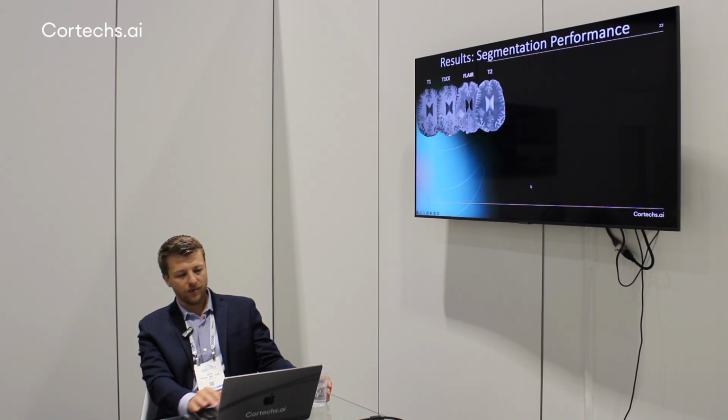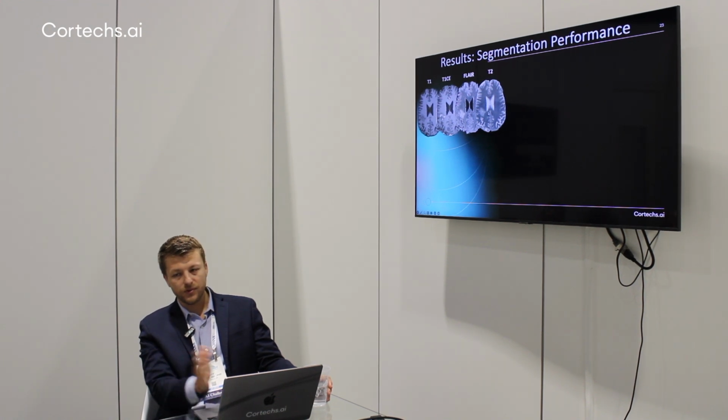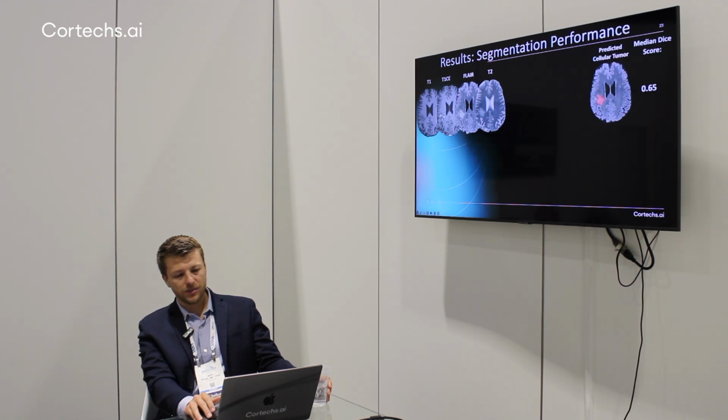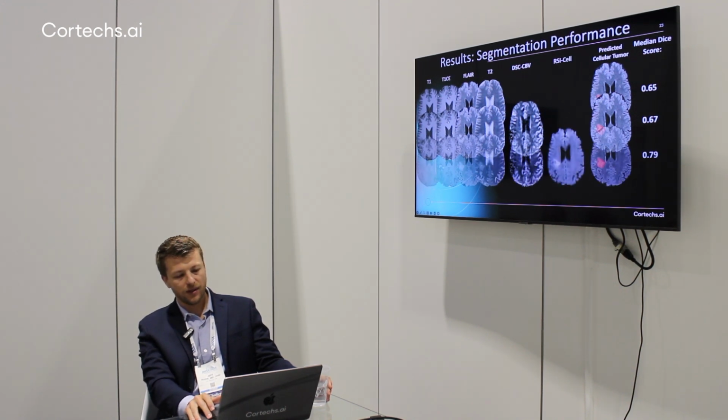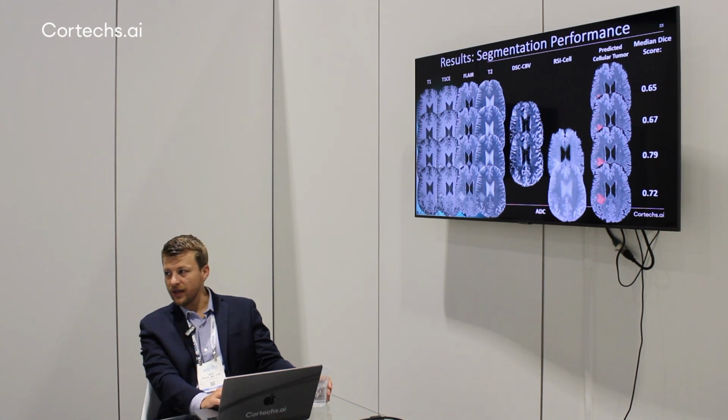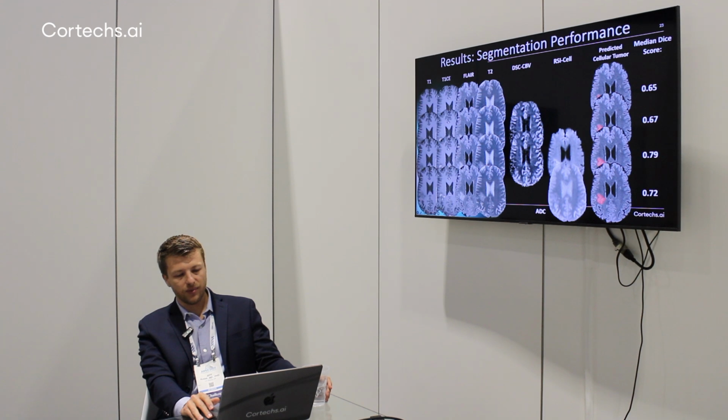So here's just an example of some of the performance of using different inputs. If you use your standard inputs that are used in most of the brain tumor segmentation challenges, we're getting a dice score of about 0.65 to predict what cellular tumor was. If you add the perfusion map, you're only slightly increased. But when you add this RSI cellularity map, is where you get the most increase in performance to really identify the areas of cellular tumor. Interestingly, if you don't have an RSI, but you have a standard diffusion, you add an ADC, you can bring back some of the performance there, because again, the RSI is just a more advanced form of diffusion, but just a standard ADC, which is pretty much required in all brain MRIs, can be useful.